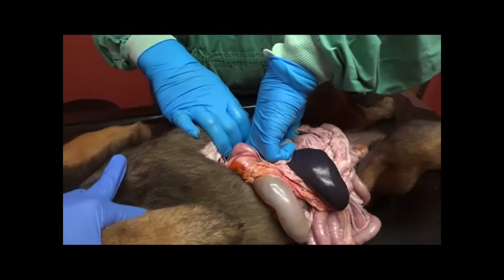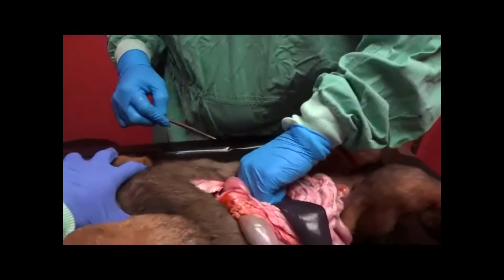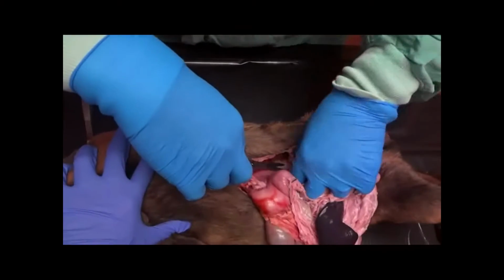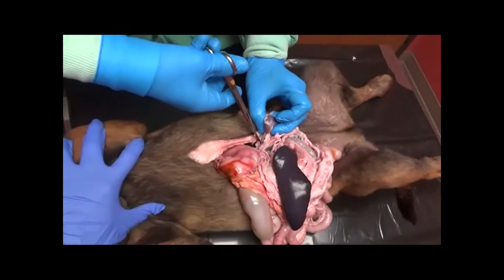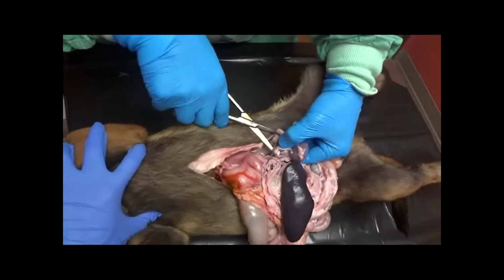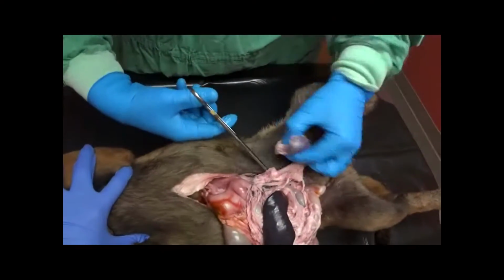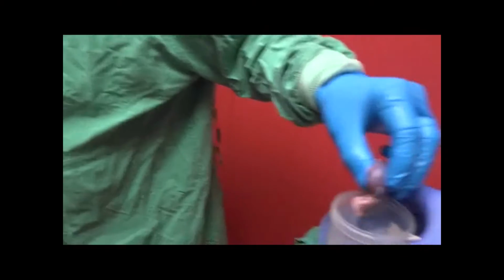A lot of times, for instance, if we are worried about a post-mortem, so we get a dead dog that comes in that we feel like has died of renal failure, we'll take those out and allow someone to evaluate them for ethylene glycol toxicity. So I'll go ahead and get that one out if I can. And you wouldn't necessarily need to send in the entire kidney, but we can go ahead and get that in formalin. Let's go small.